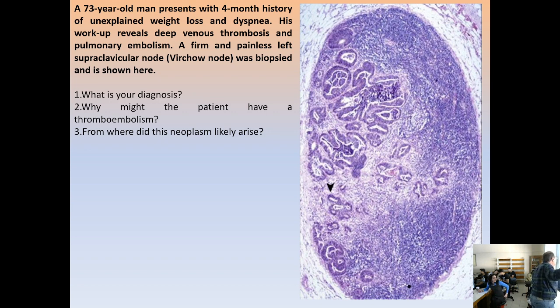because this is a metastatic adenocarcinoma. Why? Because I see that it forms glands. So it is from glandular epithelium. And of course, this presupposes that the structures have lumen. So it is adequately differentiated so as to understand where it may come from.